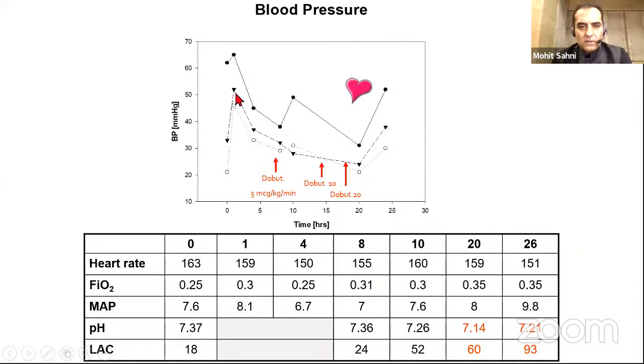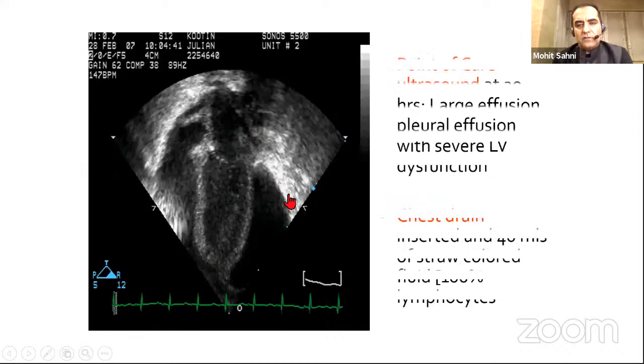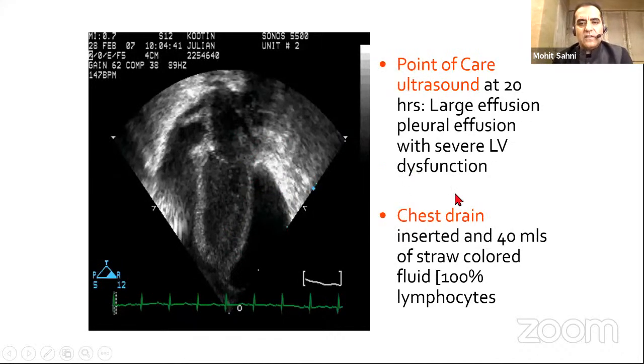Initially the baby was doing well, but started having hypotension after a few hours of the operation. Was started on dobutamine. Dobutamine was increased till 20, but still hypotensive. This small heart shows where the functional echo was done, and after this, you can see there was an increase in the blood pressures. By this time, the baby was acidotic with increased lactates. So when this echo was done, it was not the heart which was the culprit. This is what Dr. Suryavanshi will talk about. There was a pleural effusion after the operation. When it was drained and a chest drain was inserted, the baby became fine. So even when you do functional echoes, don't just concentrate your vision on the heart. Look around also. It is very important.